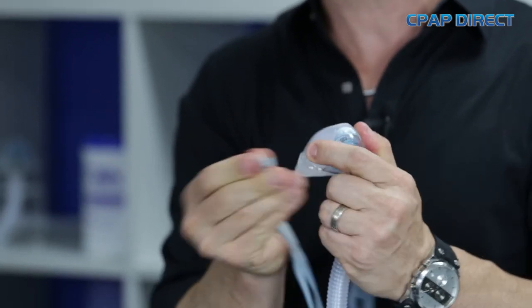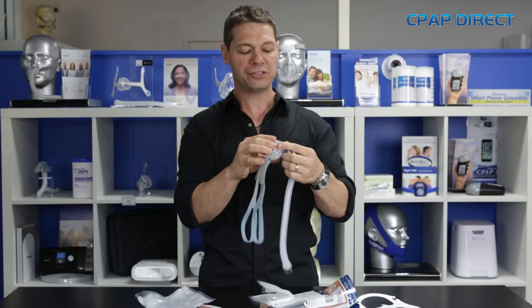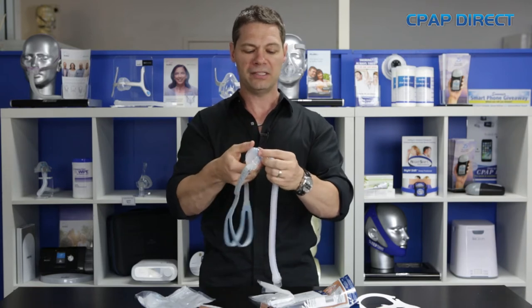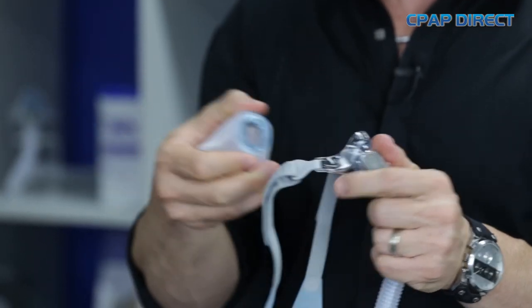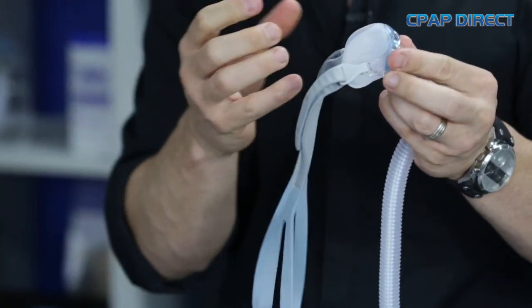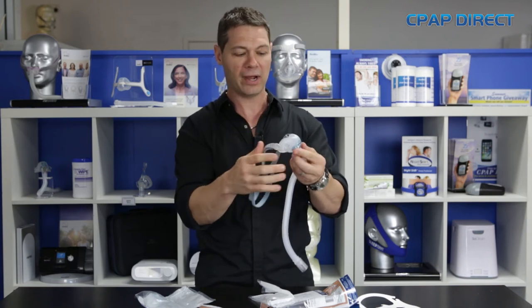Easy-to-use clips just come straight off, and they used a patent called VisiBlue as a connection system to make it easy to take the mask pillow off and clip back in. One of the things that happened on the Polaro was that the pillow would fall out even when you were using it and moving around in the middle of the night. This one clips in really nicely, which is great.